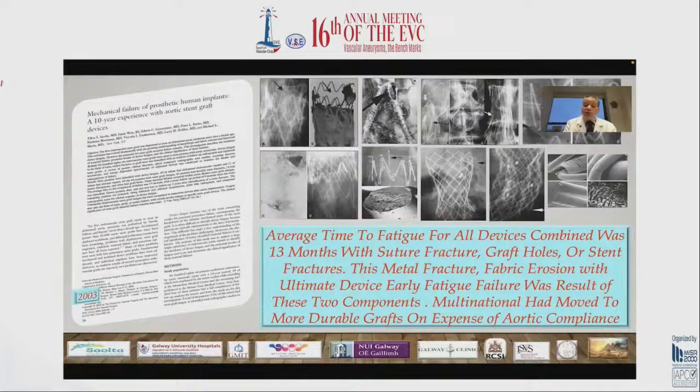Multinationals have moved to a more durable graft at the expense of aortic compliance. So a knee-jerk reflex: they put out this paper, went to the FDA, got panicked, and were going to withdraw EVAR from the market. So let's make the EVAR much more durable. By doing so, they made it a very stiff tube that creates more havoc for the patient's cardiovascular system.